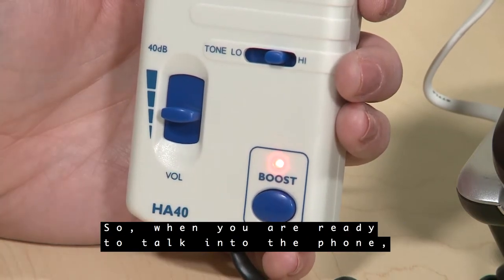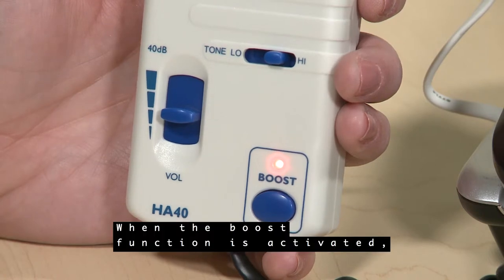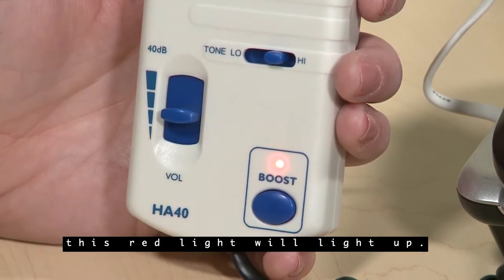So when you're ready to talk into the phone, you must release the boost button. When the boost function is activated, this red light will light up.